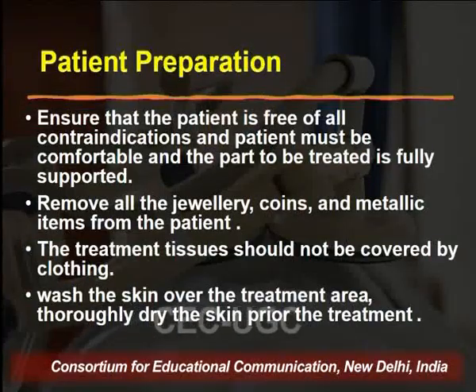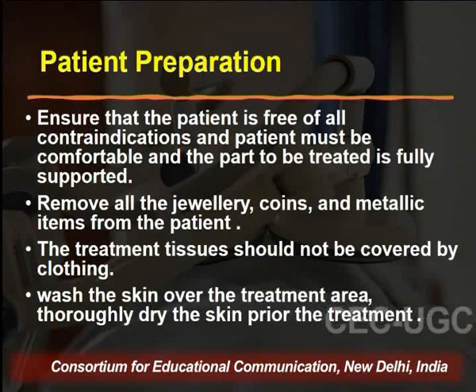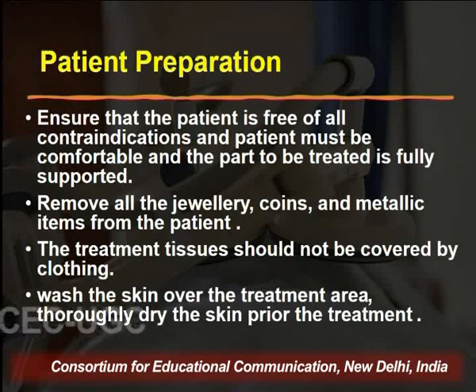Now, how can we prepare the patient? Ensure that the patient is free of all contraindications, the patient must be comfortable and the part to be treated is fully supported. Then remove all the jewelry, coins and metallic items from the patient. The treatment tissues should not be covered by clothing. Wash the skin over the treatment area. Thoroughly dry the skin prior to the treatment.